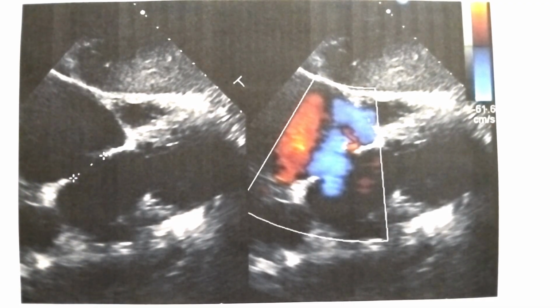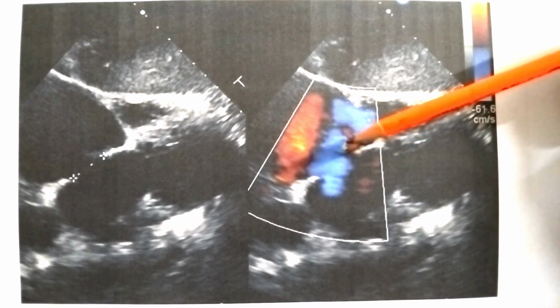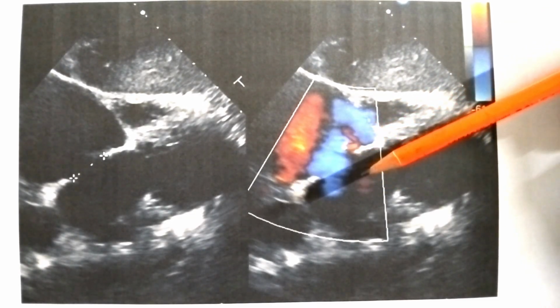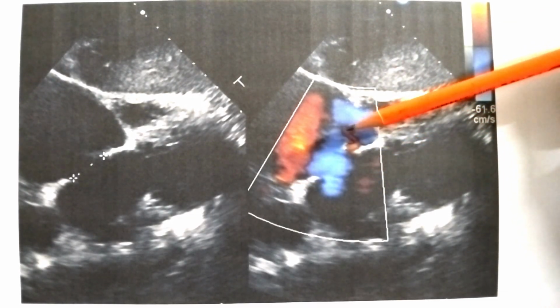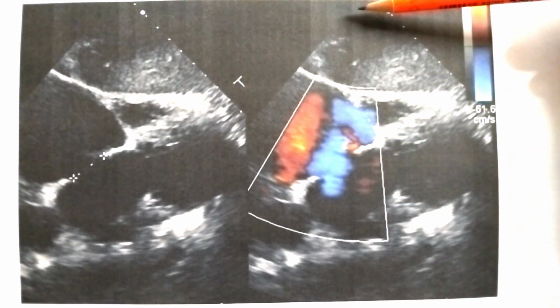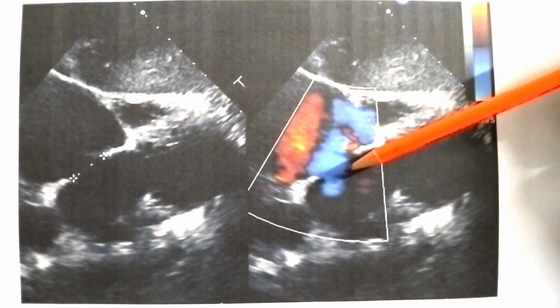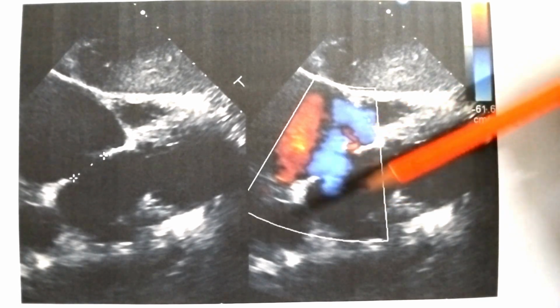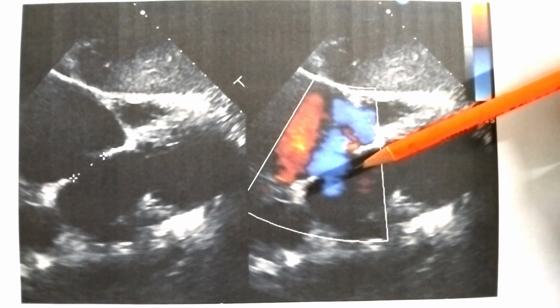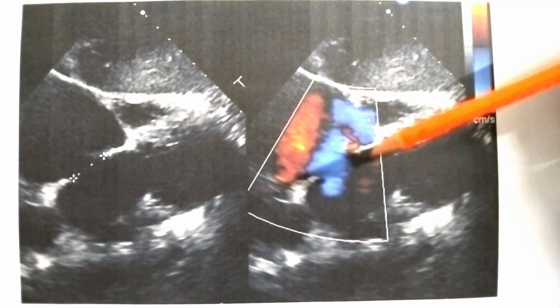Unfortunately, the window for device closure is probably over. Look at the color Doppler. The flow is right to left, from above downwards. Blue is away from the transducer. So this is blue flow away from the transducer showing right to left shunt. So this is ASD with Eisenmenger syndrome, not suitable for device closure.